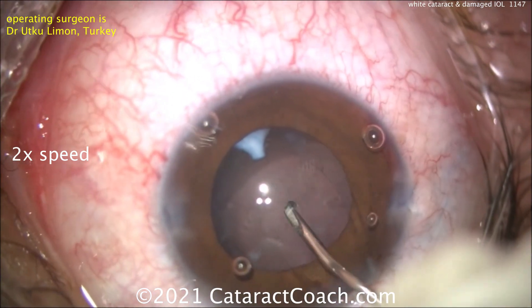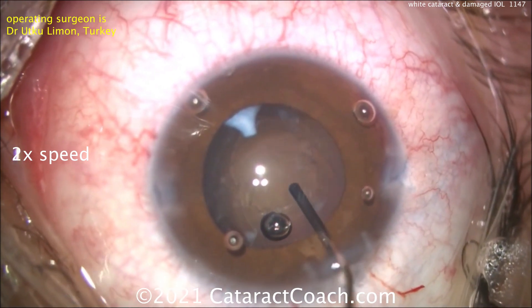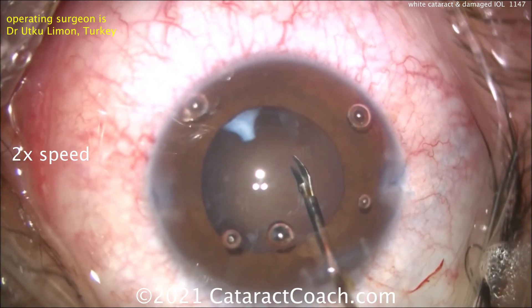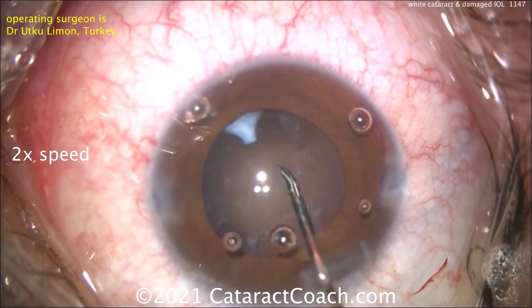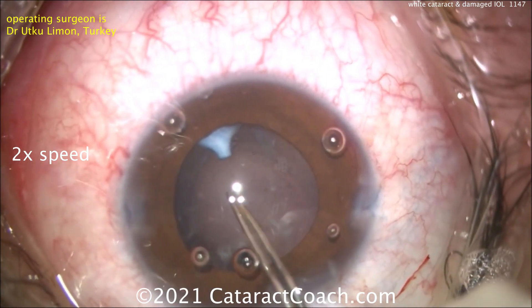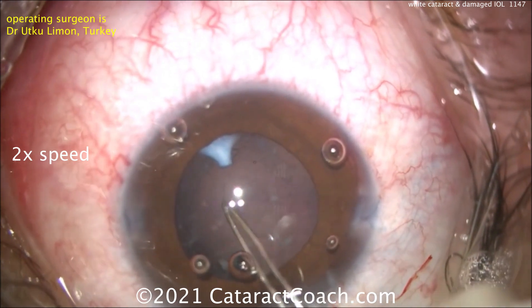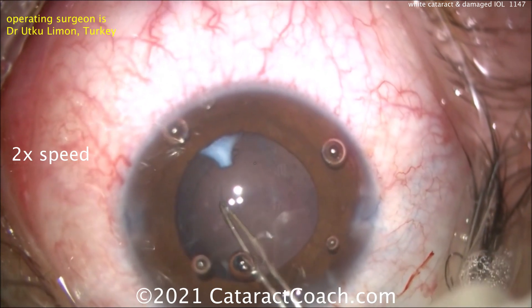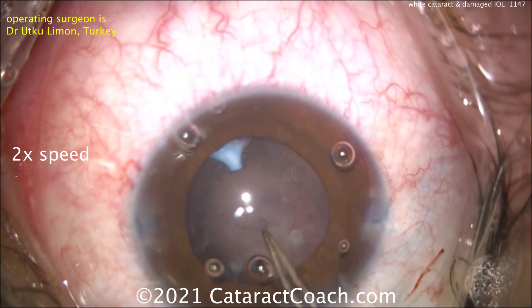About that one fibrotic area down there — don't worry about it. This patient is also going to get a posterior capsulorhexis. You see poking into the lens capsule there, placing a little more viscoelastic to protect the anterior hyaloid face, then using micro scissors to start that rhexis and making a small central rhexis here. There's some scarring of the capsule, but the surgeon felt confident enough to go ahead and do this technique of a posterior capsulorhexis.